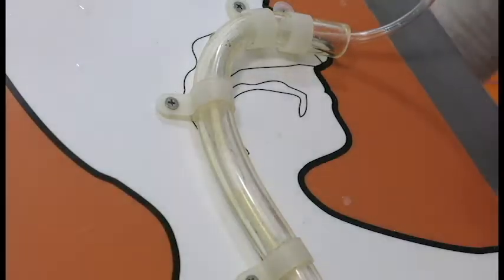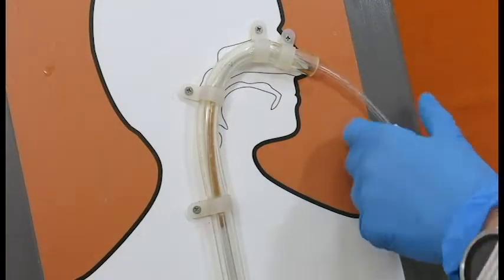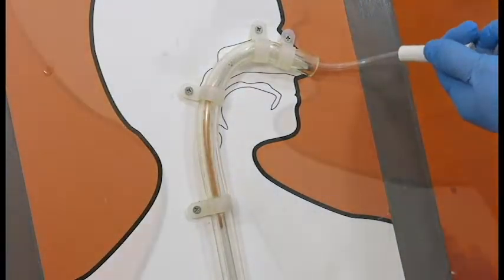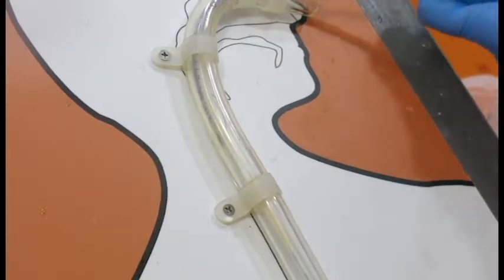We've identified two types of clogs and the techniques that are most efficient for clearing them with the TubeClear system. Hard or solid clogs may consist of both medication and protein. As the operator, you may feel some initial resistance as the clearing stem is inserted.